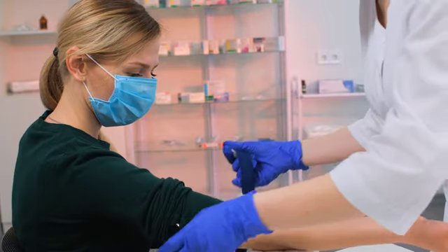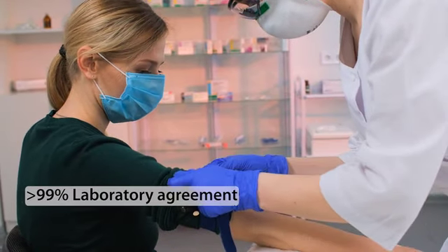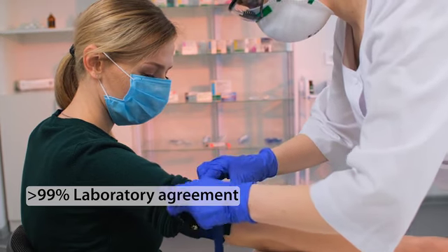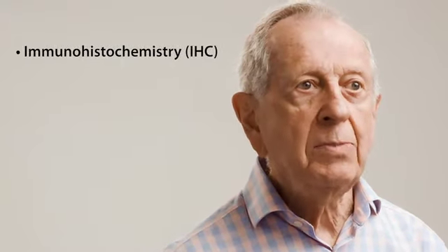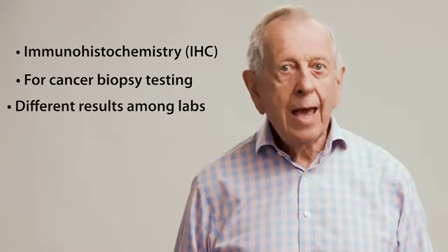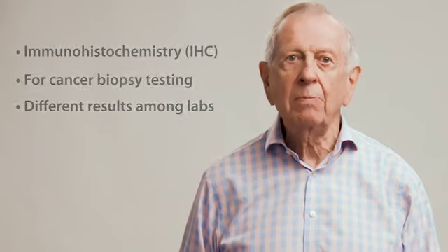When a patient has blood drawn and tested, he or she can rest assured that their results will be the same no matter which lab performs the tests. The rates of inter-laboratory agreement in blood testing are greater than 99%, but not so in immunohistochemistry for analysis of cancer biopsies. Different labs can produce different results on the same patient sample.